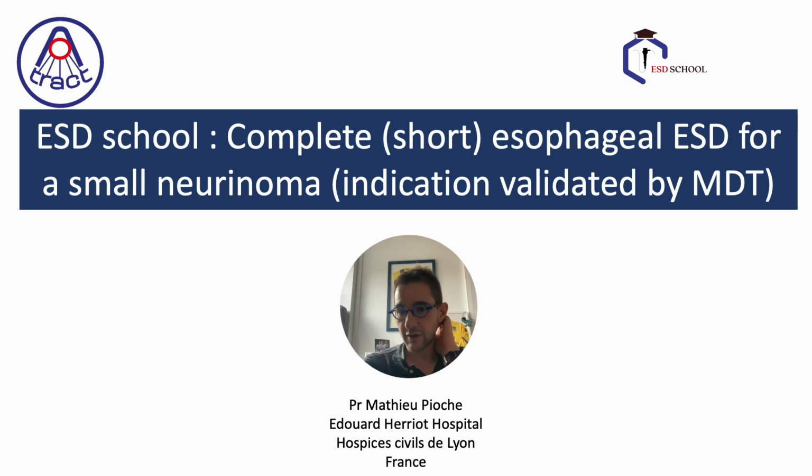This case will be performed by two people: me for the initial part of the incision and the tunneling, to be sure that we can pass under the lesion, but the two sides of the lesion were performed by one of our trainees under supervision. So it's also a way to show you how we supervise and how we are organized for the training of people. Hope it will be helpful for you.